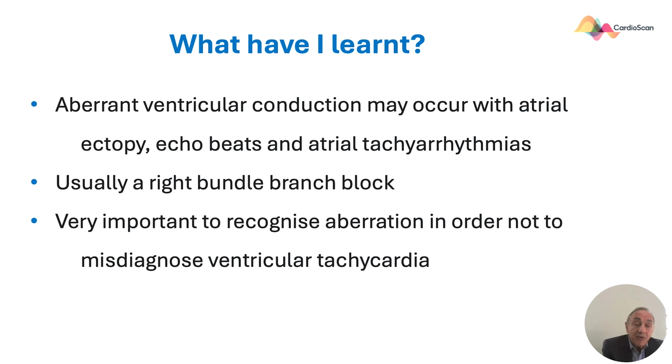I'd like to finish with a message. Somewhere in the world today, somewhere maybe in Asia today, a patient is having a defibrillator, an ICD, implanted, not because of a ventricular arrhythmia, but rather aberrant ventricular conduction. My audience is not going to do this because you're a captive audience with me today. But tomorrow it's important that you recognize aberrant ventricular conduction and not make this inappropriate error.